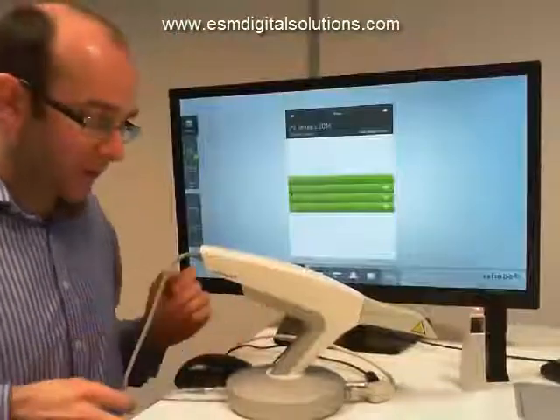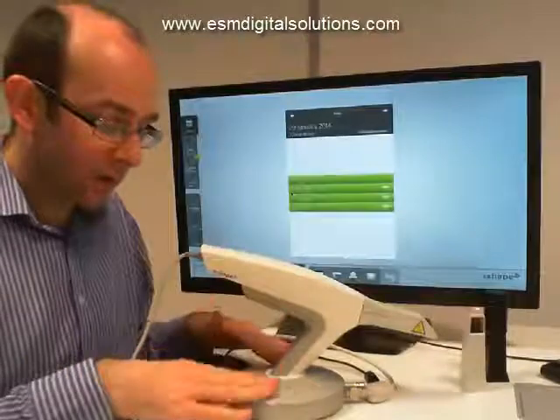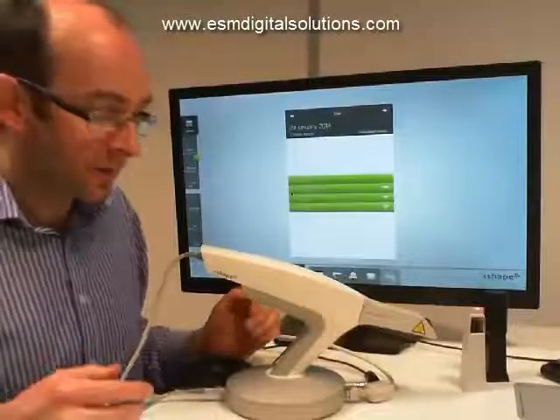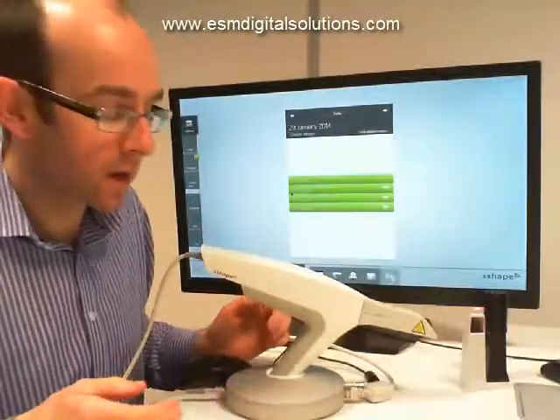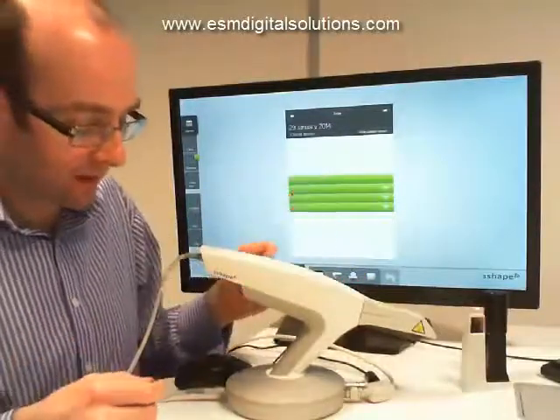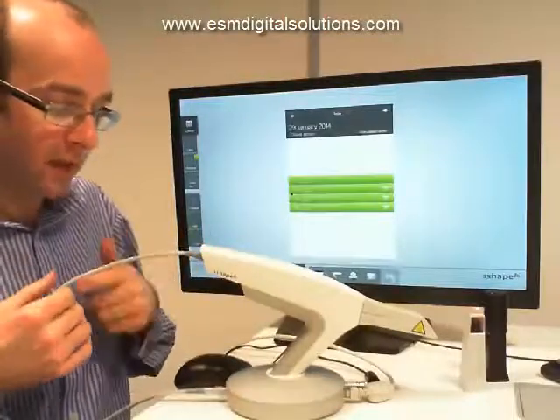We've got a couple of cables here. There's a cable joining the scanner to the pod. The cable is long enough to give us plenty of reach between the pod and our work area where the patient is, but short enough that it's not dangling along the ground. People often ask about a wireless version. The most significant reason there isn't one is that the level of data being generated, and the speed at which it's generated, is phenomenally large.